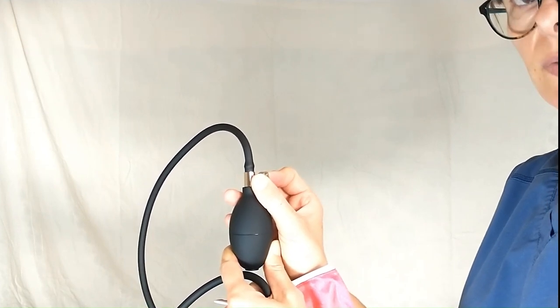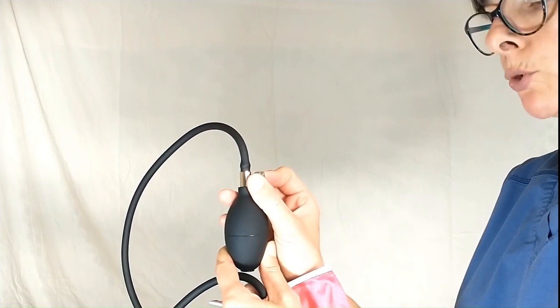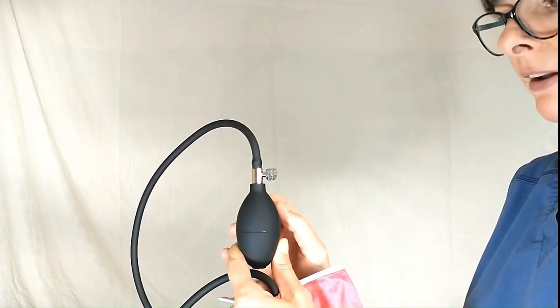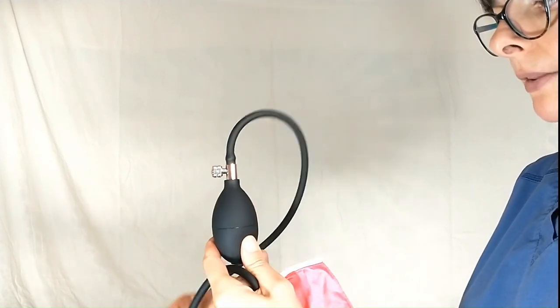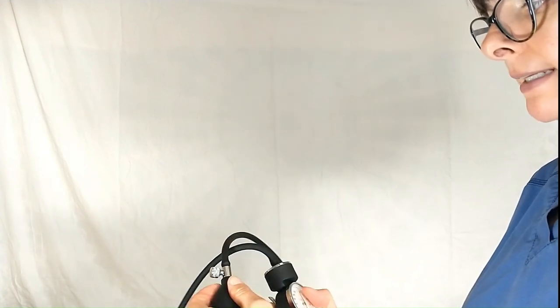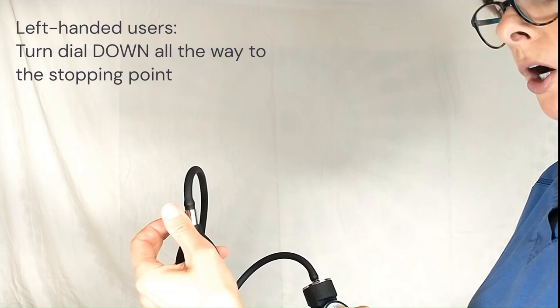And you really want to do this very slowly because if the dial releases too fast, you won't be able to see the actual reading. Now if you are left-handed, it helps to turn this bulb the other way and actually hold it with your left hand. Now in this case, you will need to turn it towards you to lock it.